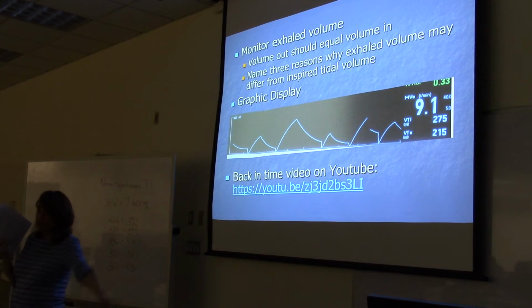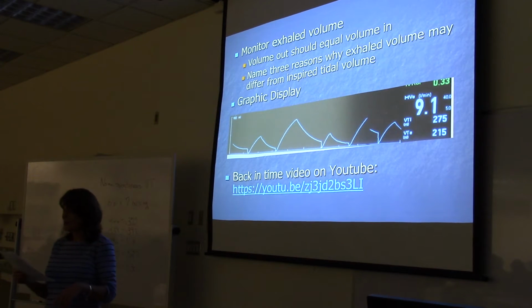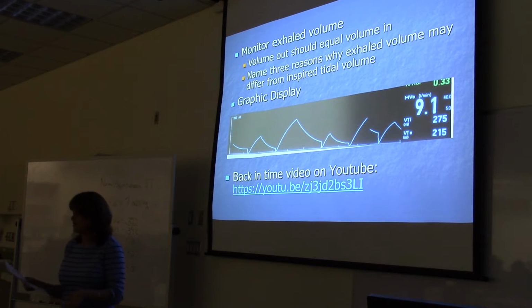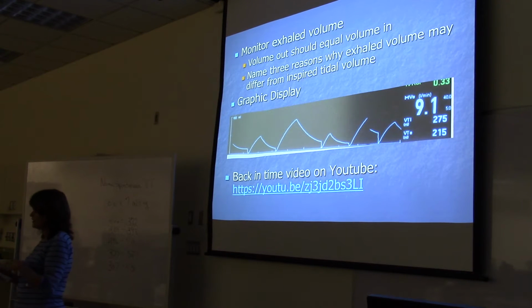And some of it will go out the chest tube. So that's your bronchopleural fistula. All right, so there are four reasons why you're not getting your volume back. Now you could be getting back more volume than you put in. I'll give you two reasons for that.